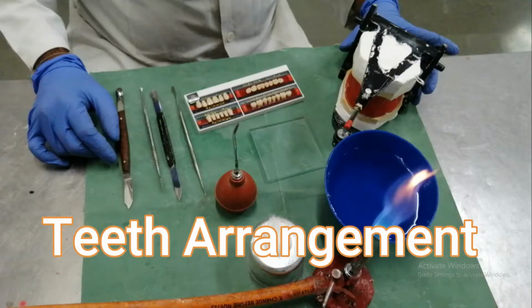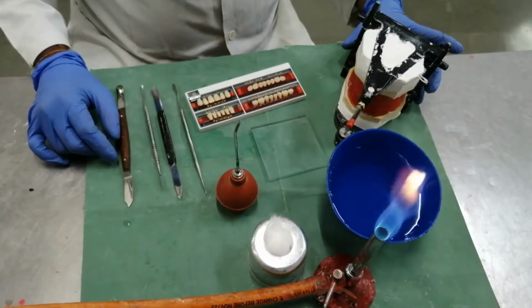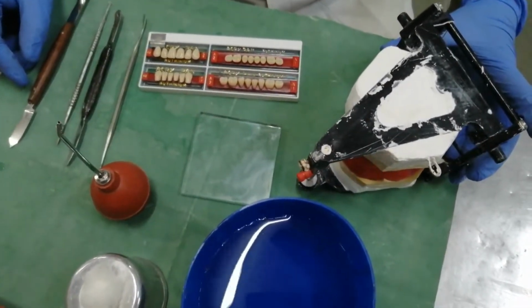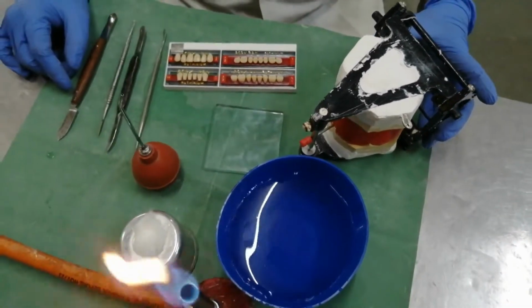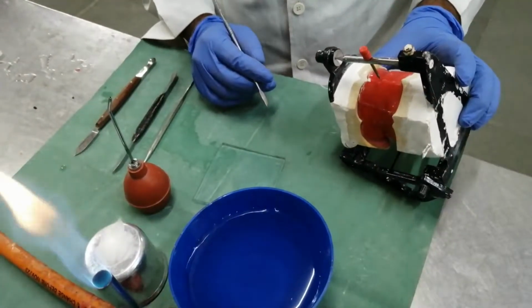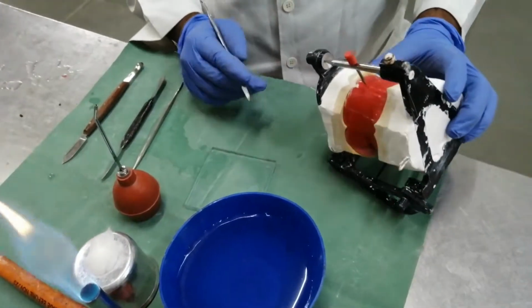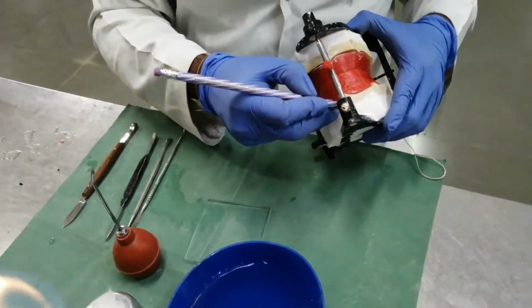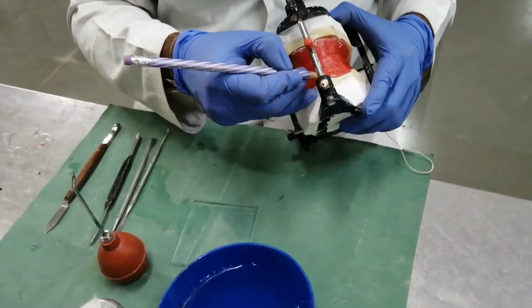Hello everyone. Today's practical is arrangement of maxillary teeth. These are all the instruments and material that are required for the practical. First of all, you need to transfer the midline on the cast and on the plaster.